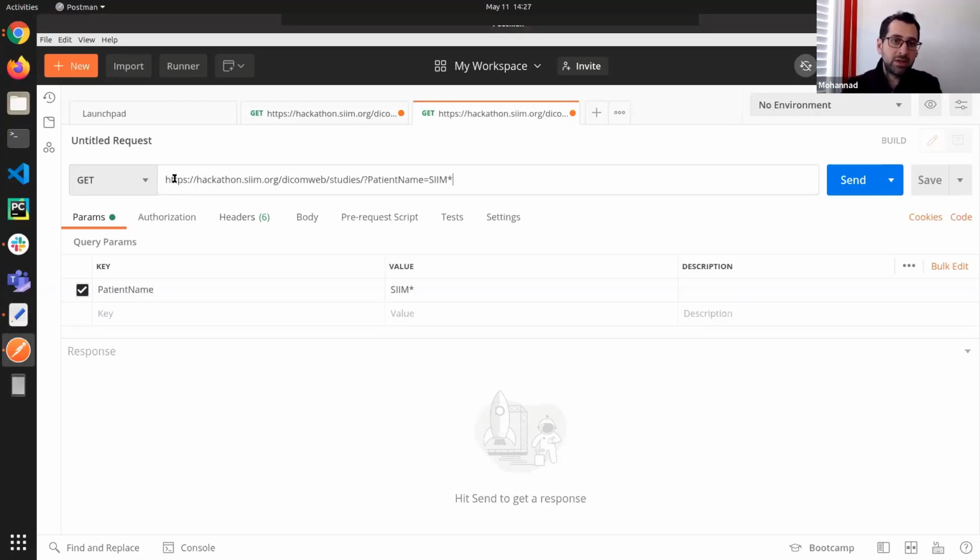So as you can see here, HTTPS hackathon.siim.org. So we're using the hackathon server /DICOMweb, meaning we want to talk to the DICOMweb /studies, that's standard syntax. And then there's a question mark. The question mark is a way of denoting that I'm running a query. And in this case, my query is really simple. I'm saying I want anything with patient name equals SIIM star.